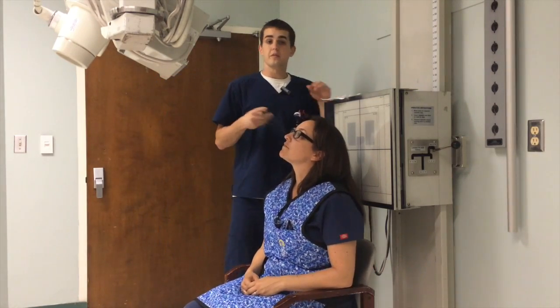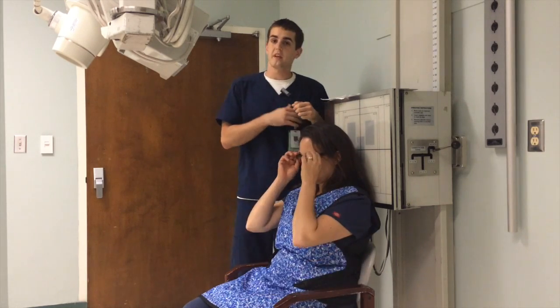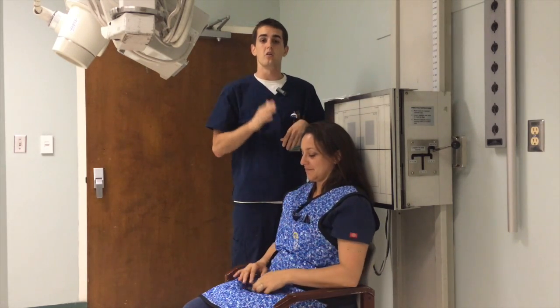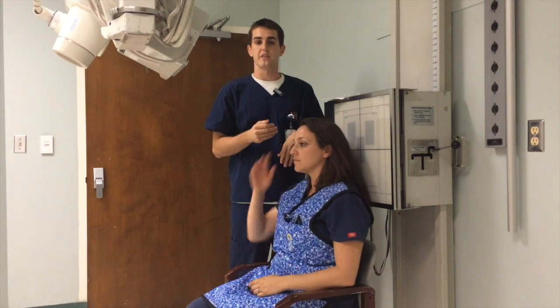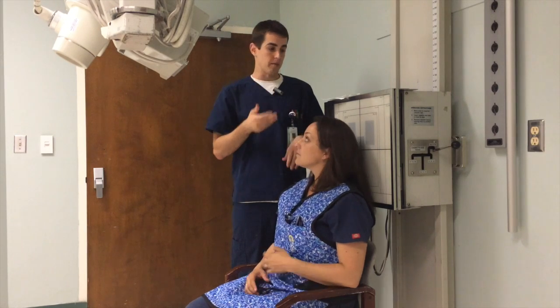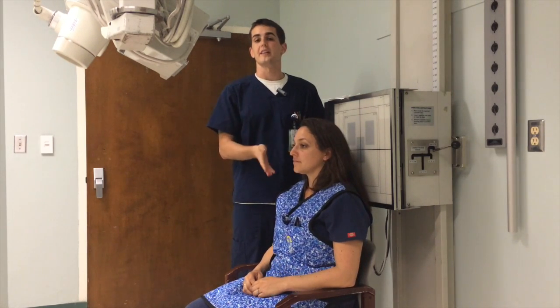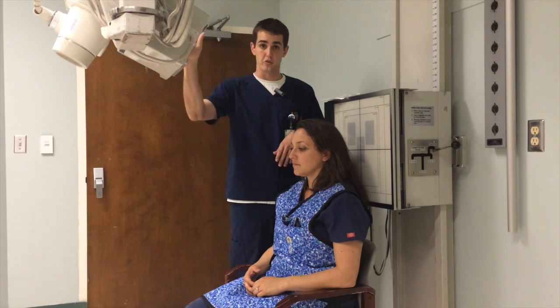All right, so the first image we're going to do is an AP axial Towne method. So we're going to get the OML perpendicular to the IR by tilting the head up, tilting the head down. We have a 30-degree caudal angle on the tube.